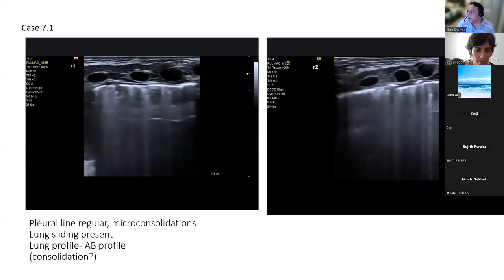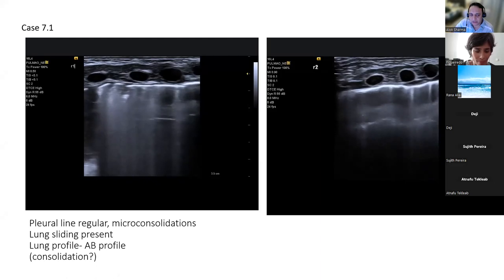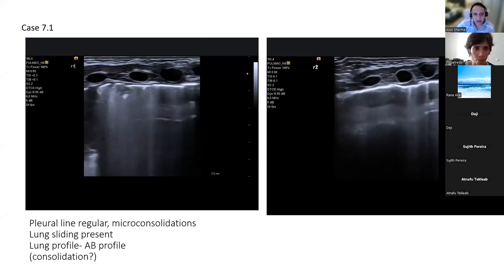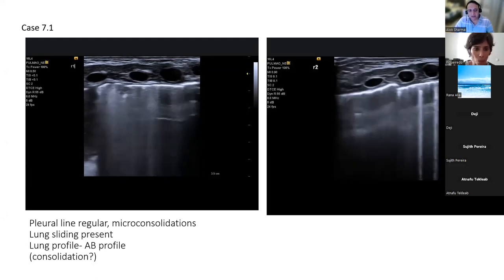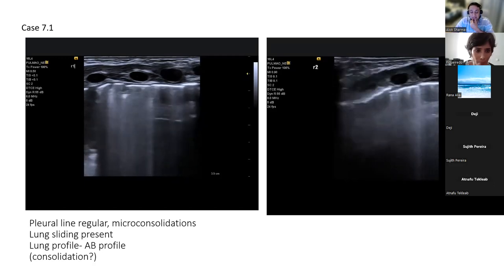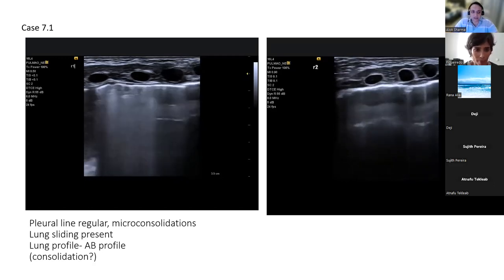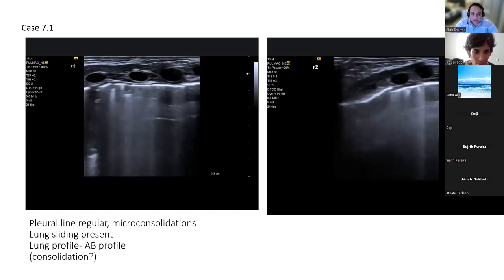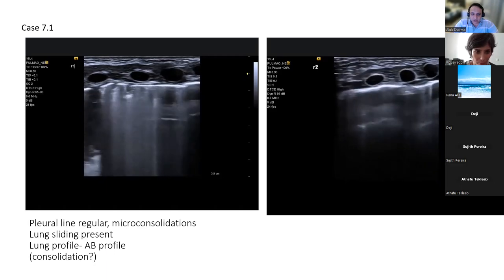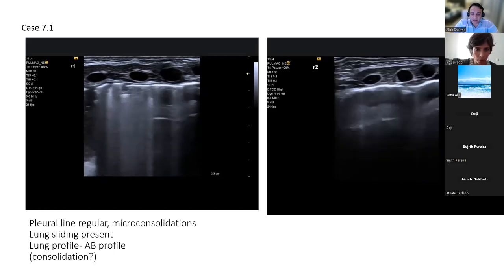So what often happens is when we do the R1 region, we miss the apex where you'd see the thymus. When you see something like that, go a little bit higher to see if you can get the thymus as well. My gut feeling is you have thymus just above. The question is whether that is a deep consolidation. I agree. I'd be very suspicious at this stage. The reason I'm also suspicious is you can just see some dynamic bronchograms. Can you see how they move in and out? If you just focus on that region.